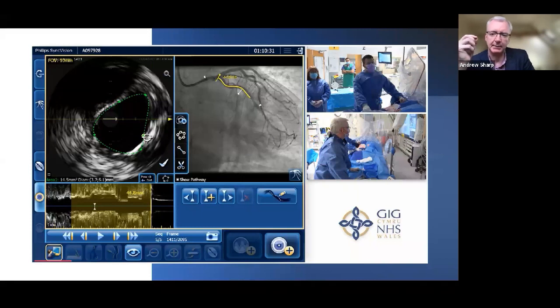And remember, we're aiming for more than 5 millimeters squared at the ostium of circumflex, according to Kang's formula from his left main study in Southeast Asia. And here I've been a little bit rough and ready with the measurements. But here at the ostium of circumflex, we've got a slightly elliptical opening, but that's okay. It doesn't matter. It's the area that is the key. And we've got an area of 14.5. So we're pretty pleased at this point, Sean, right?